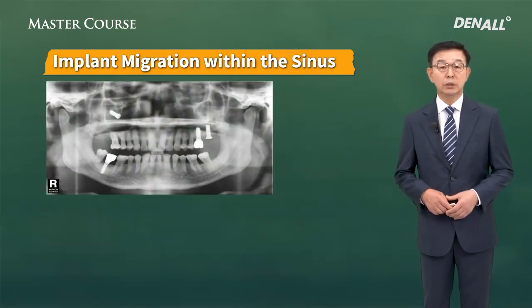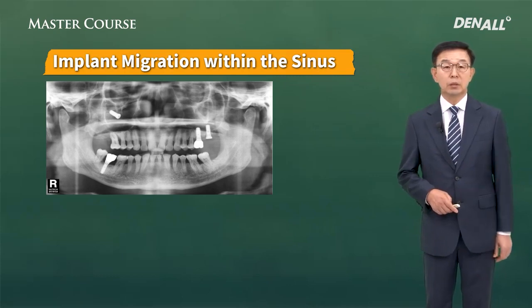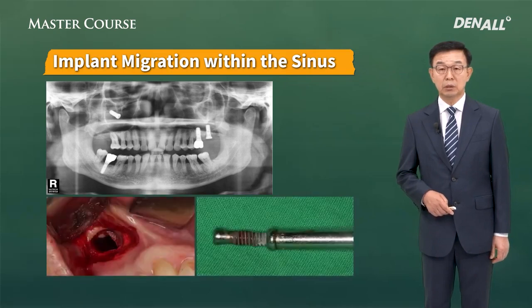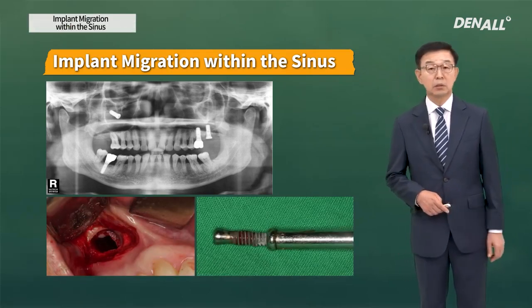In the case of this patient, in number 17, during secondary surgery, the implant fell into the sinus and the patient came to my dental clinic. Immediately, a lateral window approach was taken to remove the implant.